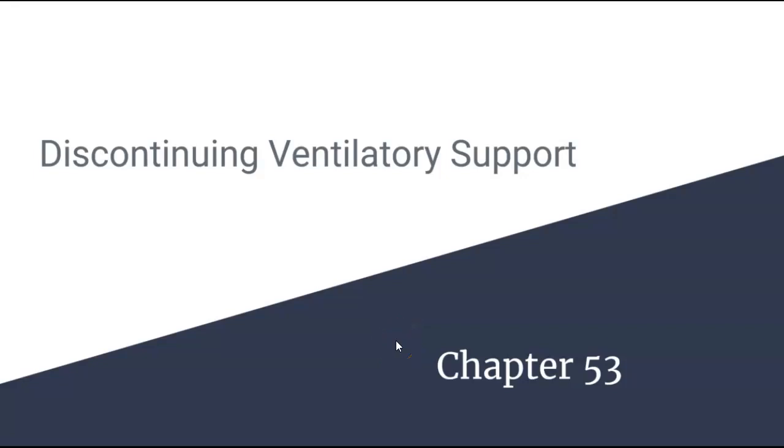Okay, so we're moving into our second to last module for life support. And in this chapter, we're going to be talking about discontinuing ventilatory support, or that process of weaning from mechanical ventilation. This process is really just covering that transfer of the work of breathing from the ventilator back to the patient.